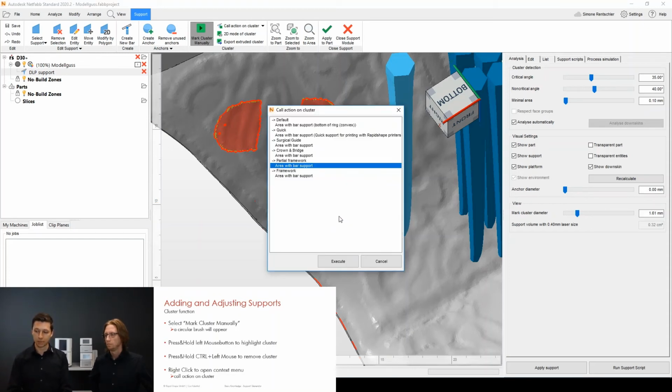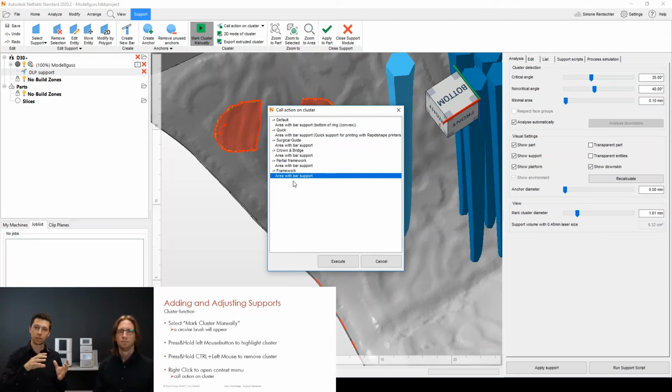If I open this, we can see the different support scripts in here, which are, as Robert mentioned, in the engine, and one of them is this one, the framework, is also done custom made in here. So as you can see, I can only execute the actions inside of a script and not the script itself. So it's just important that you know, if you select a script and the execute button is grayed out, that's normal. You only can execute the actions inside, because the script is always applicable for the full part and not only for a special manual cluster.